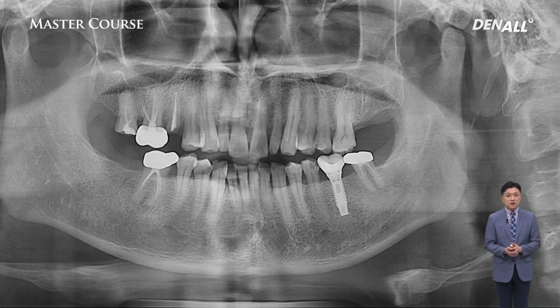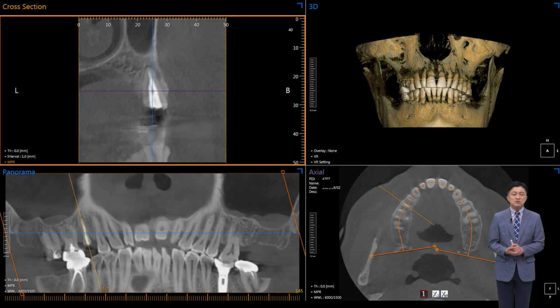In the case of this patient, in number 15, root fracture occurred. The easiest area to do immediate implant placement is premolar. If you are going to attempt immediate implant placement, you can try starting off with the premolar in the upper and lower. I believe this will lead to better result and you can gain more confidence with it.